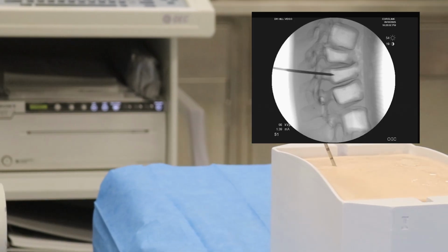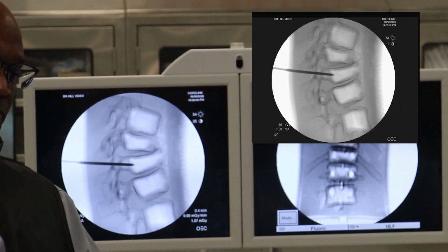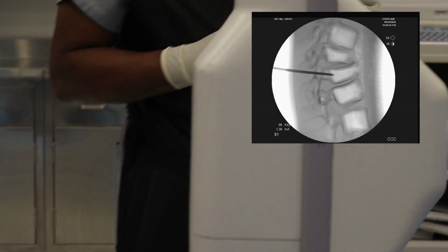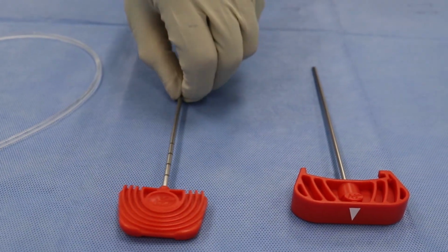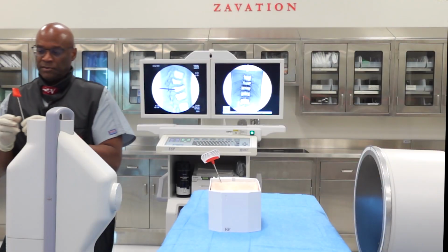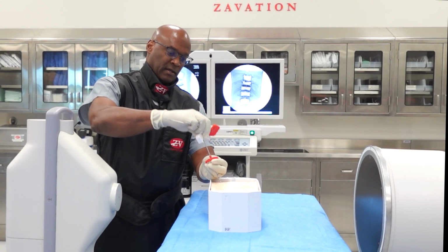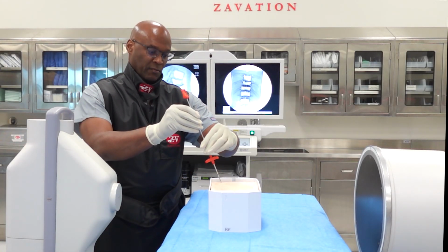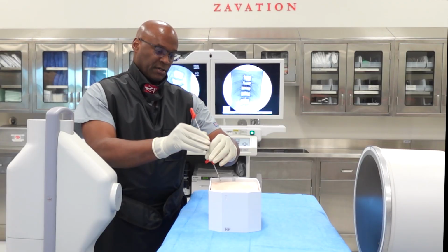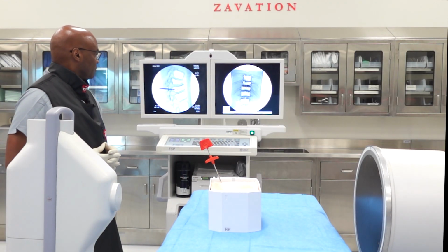So the next step in the procedure is to use the hand drill and drill to our target endpoint, which would be in the anterior third of the vertebral body. This is the hand drill that we will use to complete our access into the vertebral body. The inner trocar of the jamshidi is removed, and then we can follow the progression of the drill under fluoroscopy.